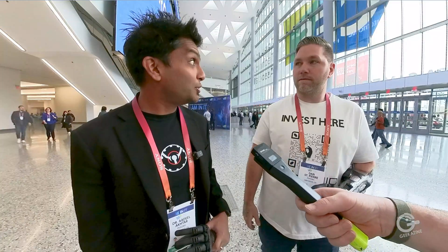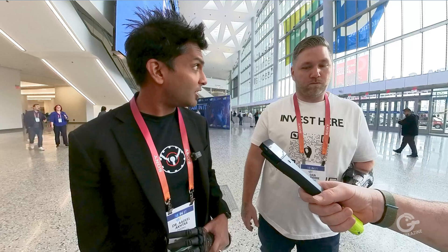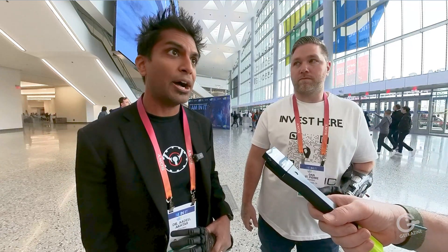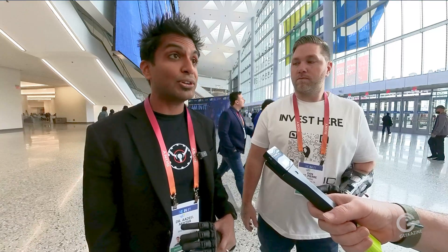How much pressure can you get on that? You can lift about 50 pounds — like a 50-pound kettlebell swing. We've maxed it out at 78 pounds. But it's still delicate enough to hold a raspberry without crushing it.